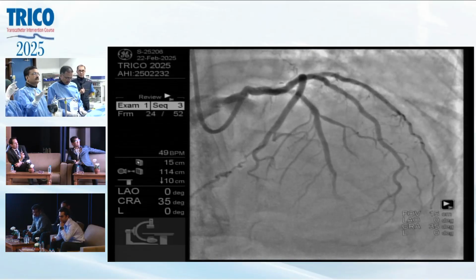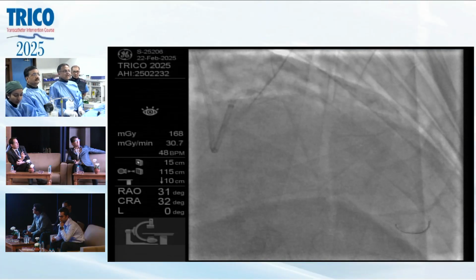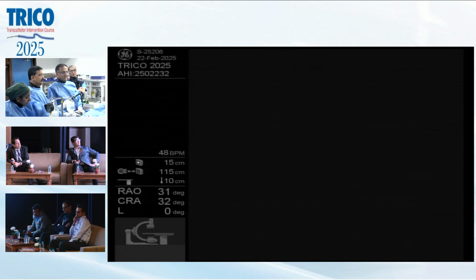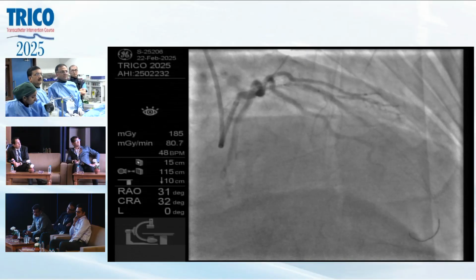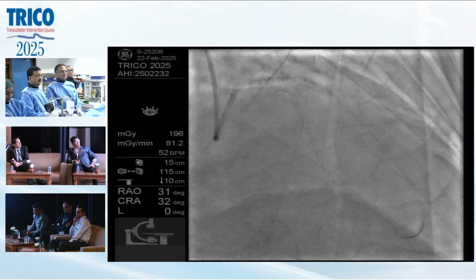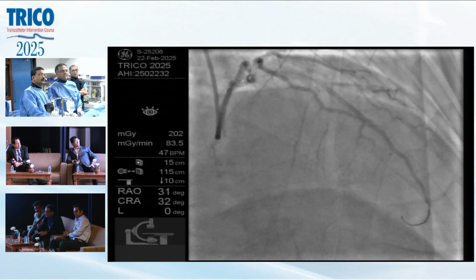I guess the question, Sam, is what is going to be your finding on OCT that's going to make you want to do atherectomy? I think if it's circumferential calcium, we have more options. It all depends on what tracks in there. I was reassured that the OCT catheter went there, so I think the odds of needing atherectomy just went down. My guess is there will be some calcium, but not so bad that we would need rotablator or orbital. As long as the balloon is there, maybe a good idea to do a stent boost just while it's there, so you get some more idea.